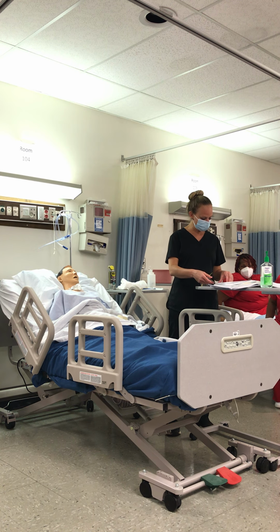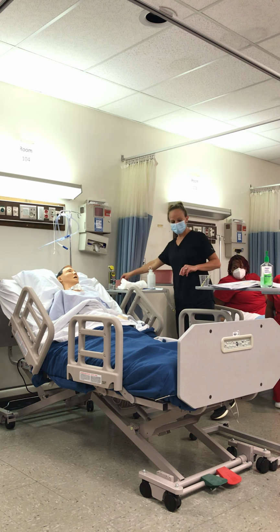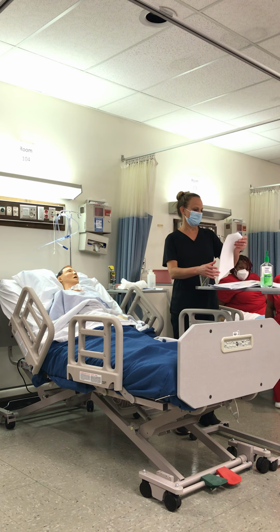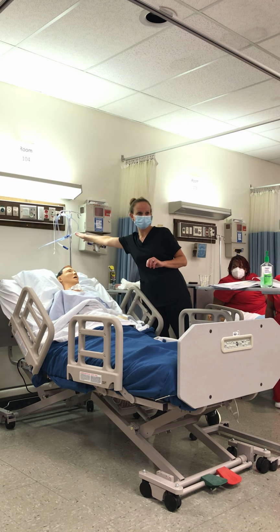Our flashlight, stethoscope. Why do we need our stethoscope? Make sure it's in the right places. Right? And gloves. Make sure I haven't missed anything over here. Got to mark my tube. We want to always make sure we've got suction, okay?